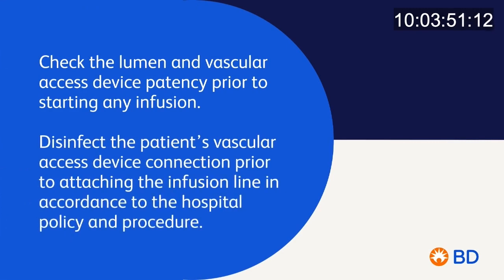Check the lumen and vascular access device patency prior to starting any infusion. Disinfect the patient's vascular access device connection prior to attaching the infusion line, in accordance with hospital policy and procedure.